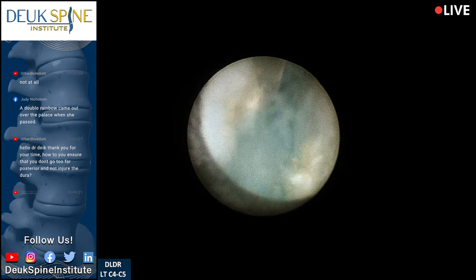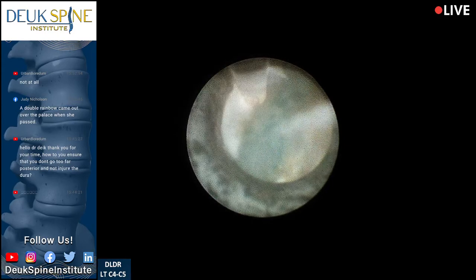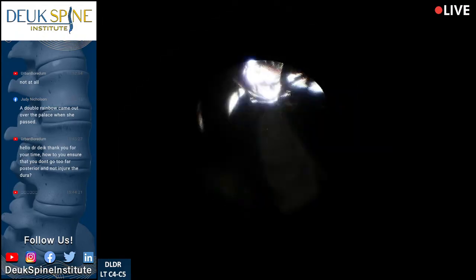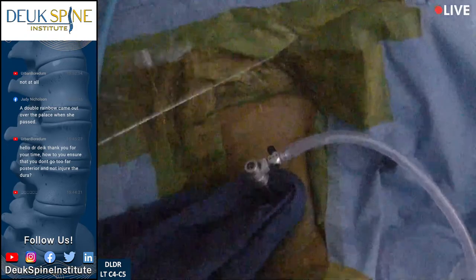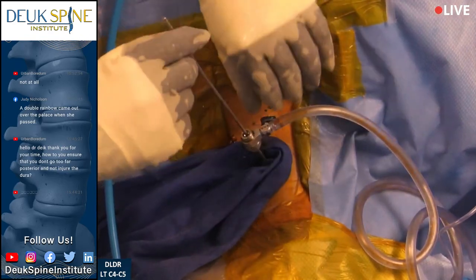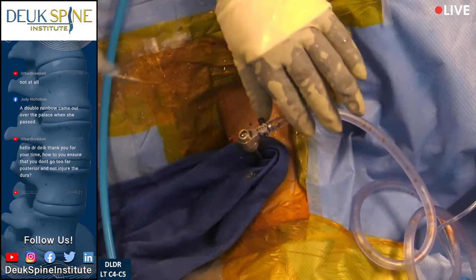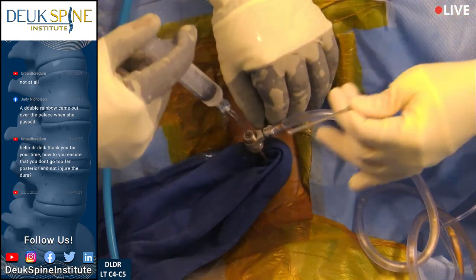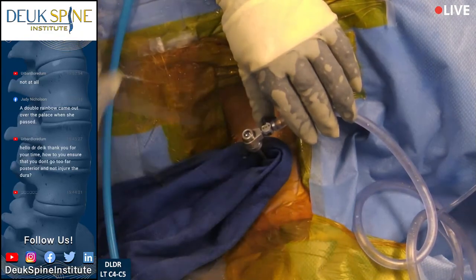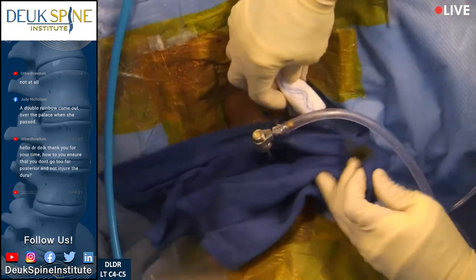The Koreans were doing this surgery with patients awake and moving around, which I think is a really bad idea. We're done — I don't see anything else coming out; I've cleaned the tear up quite nicely. Our first two patients are doing fantastic — they've both gone back to their hotels. One was from Washington, the other from Nicaragua, and they're both very happy. We'll see them tomorrow hopefully for some testimonials.